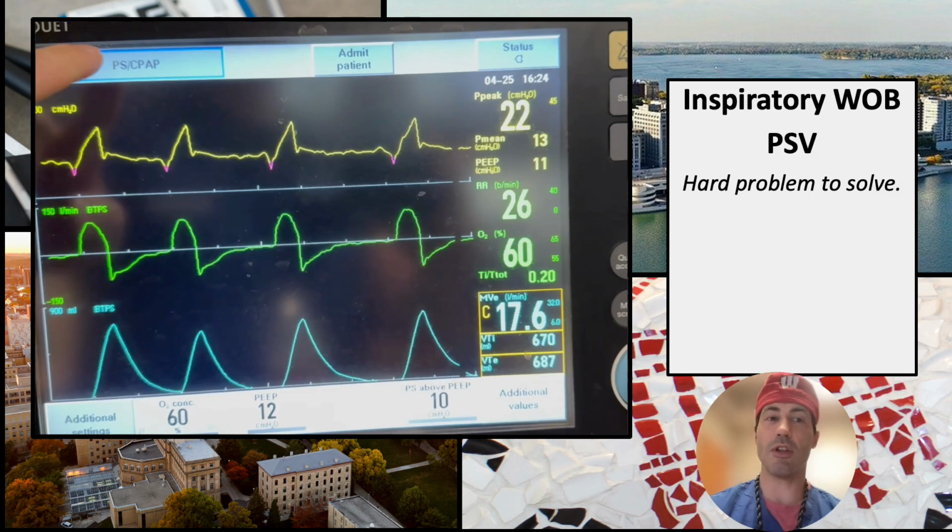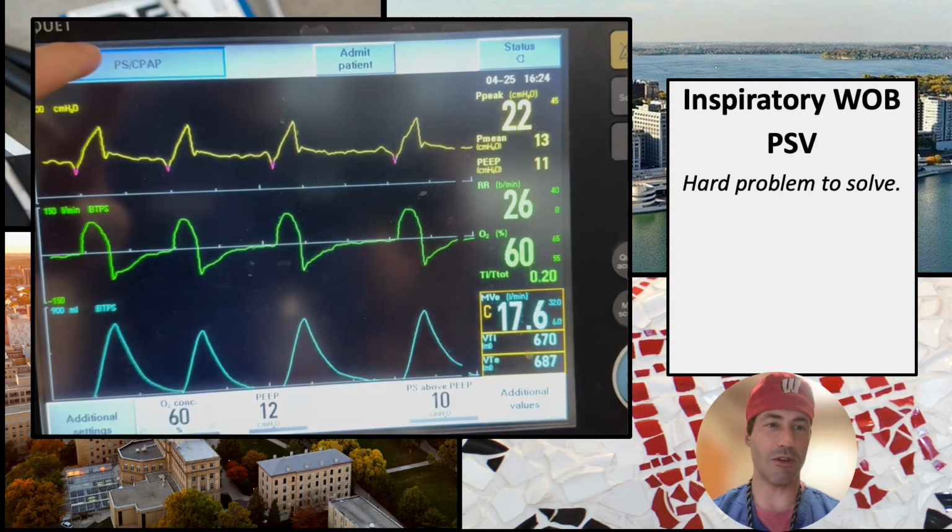The second thing I do is I simply turn the pressure up. If they're working really hard to breathe, I go up on the pressure to support them more. Their transalveolar pressure gradient's probably not that different doing this. But when that isn't possible, or I should say when it's not possible or safe, I do the third thing, which is I sedate them more, in addition to, of course, treating the underlying condition.